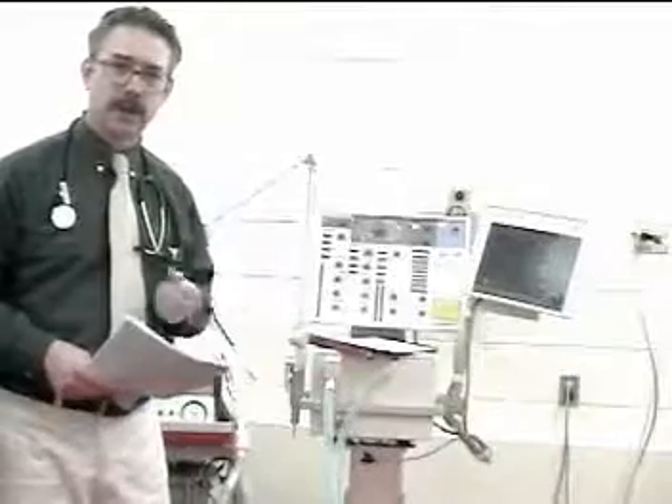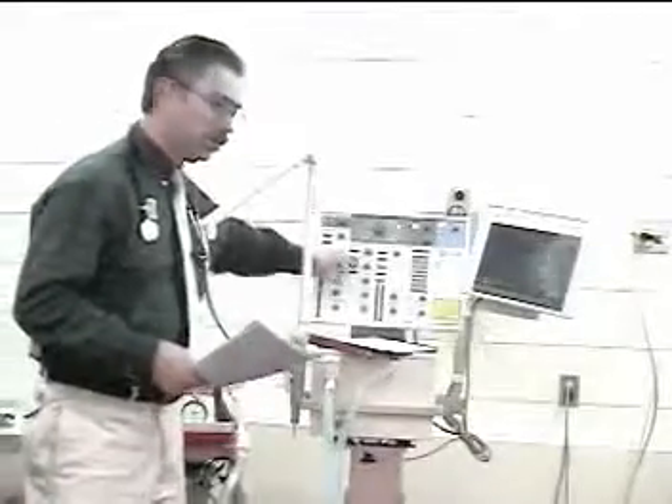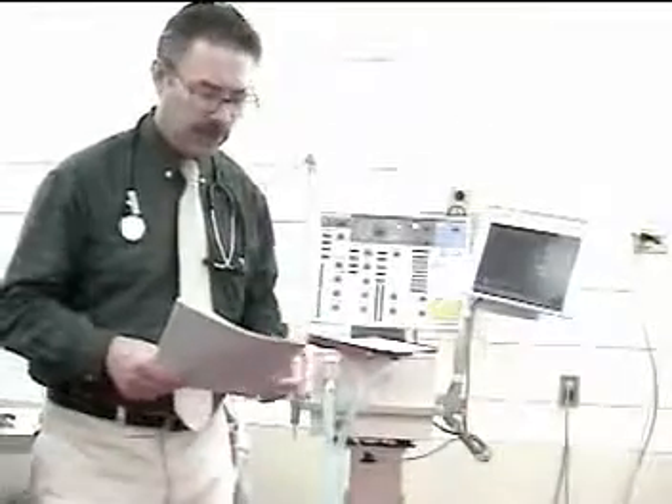Look at measured and set rate. The set rate should be consistent with the order, while the measured rate will include any patient-initiated efforts.